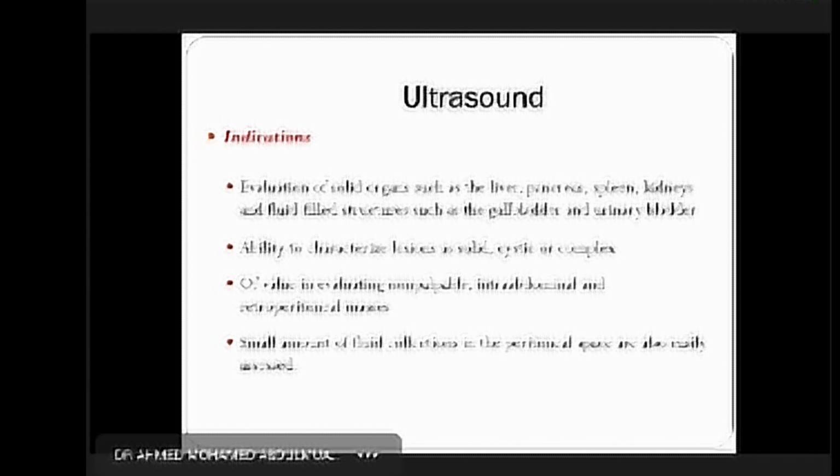So it is very good to decide by ultrasound whether a structure is cystic, complex, or solid. Then it is of value for evaluating non-palpable or intra-abdominal and retroperitoneal masses, and a small amount of fluid collection in the peritoneal spaces is easily seen.